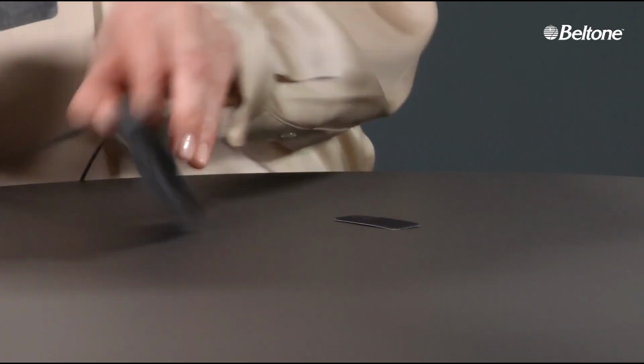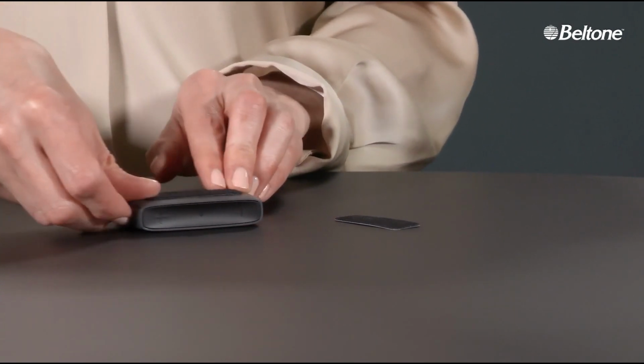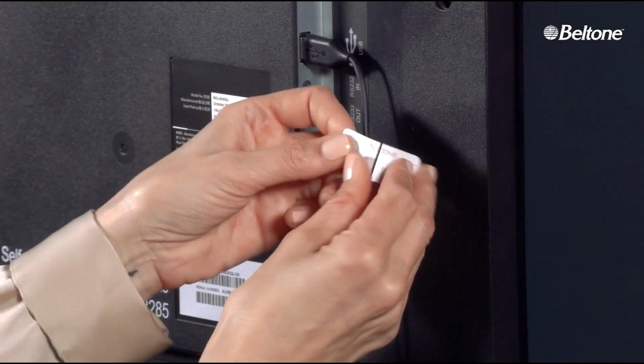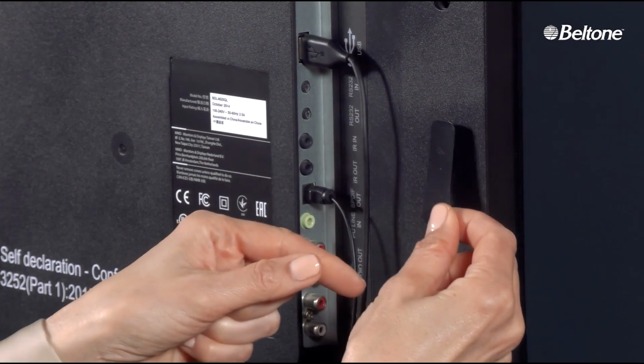The device is turned upside down and the adhesive side of the strip is stuck to the bottom of the streamer. The paper is removed from the adhesive side of the second strip, and it is attached vertically to the back of the TV, next to the outlets.